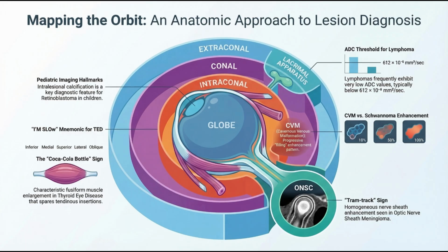Wow. So they look at the scan to see where the infection is relative to that septum. On a CT scan, the radiologist relies entirely on that thin geographical line of the septum to tell the ER doctors whether they are dealing with a simple bug bite or a life-threatening emergency requiring IV antibiotics and surgery. In that same outer space, the source contrasts two very different pediatric tumors, infantile hemangioma versus rhabdomyosarcoma.